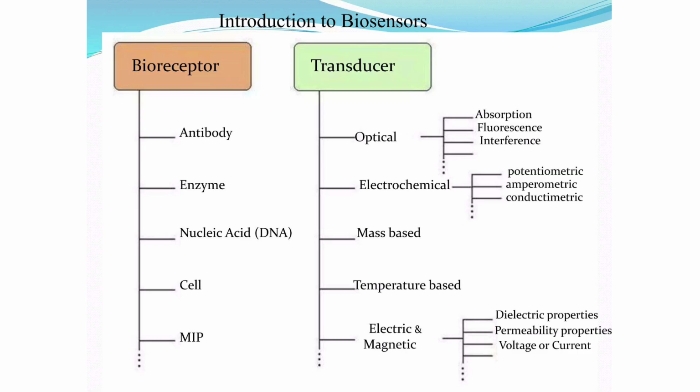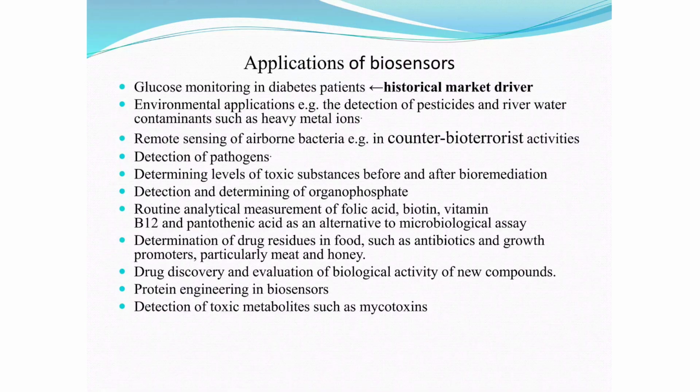The magnitude of this current is directly proportional to the rate of hydrogen peroxide production, and it gives a highly linear, precise measure of the original glucose conversion.